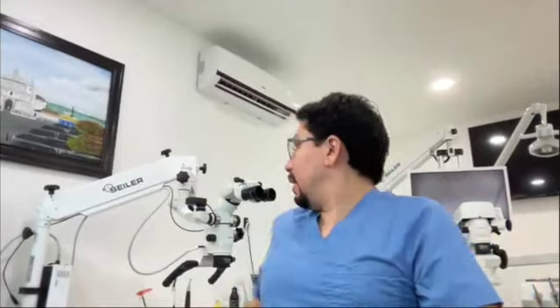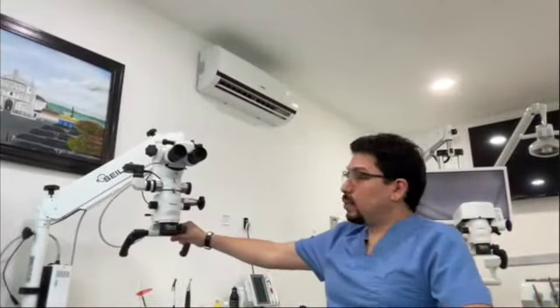And it's difficult to have fine and precise movements if you do not generate that eye-hand coordination. And that's the main reason why getting used to the regular microscope is more difficult. And it generates a lot of frustration.